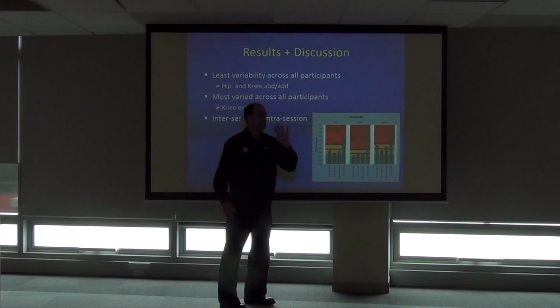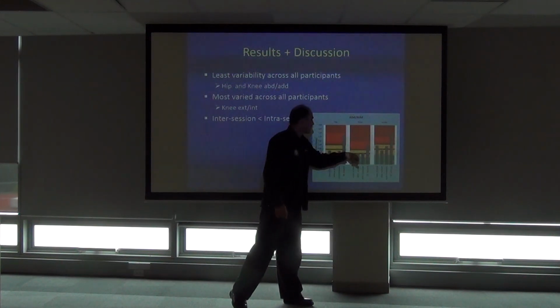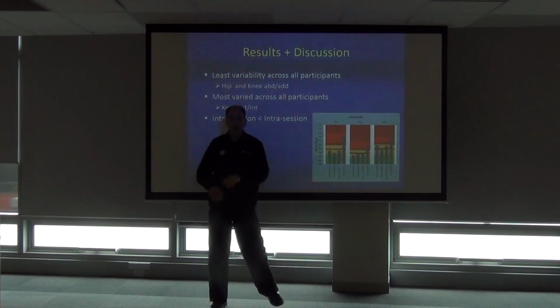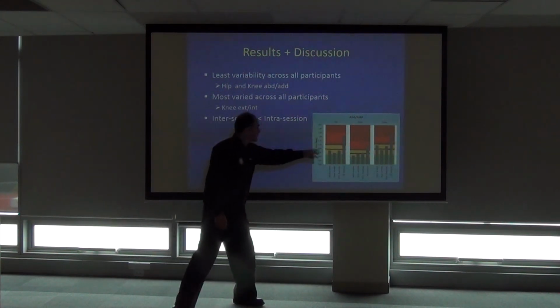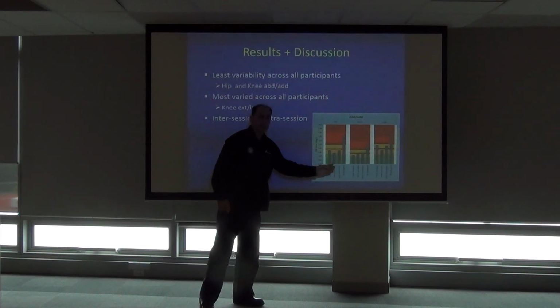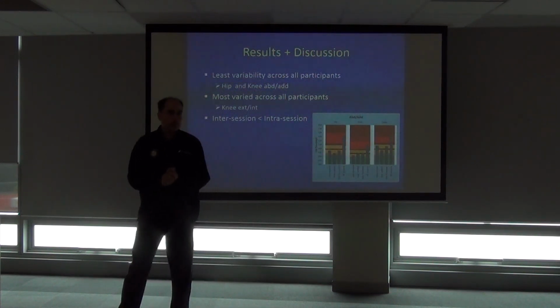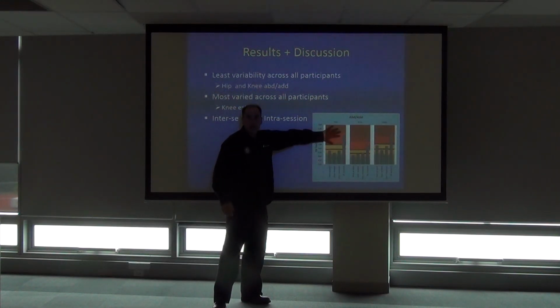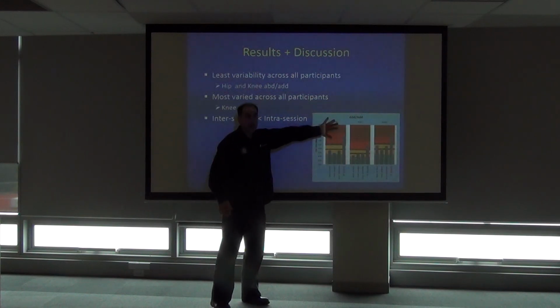That's all angles except for this one here, that's the only one, the knee adduction was a slight decrease. But every other one, there was an increase. And normally it's a big decrease, another big decrease, going intra-session, inter-session, inter-exam. Why is this? Well, part of the reason is the nonlinear error, and all their rotations are confounded and completely overwhelmed by nonlinear error.